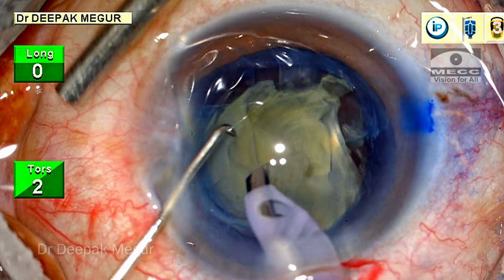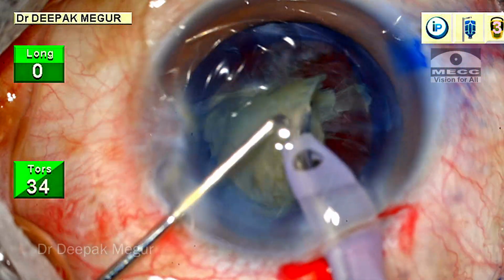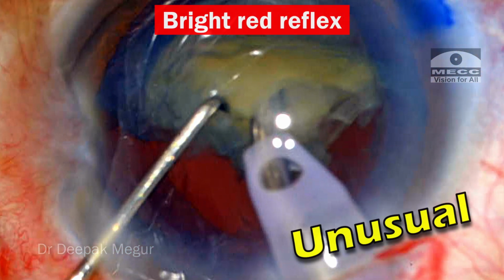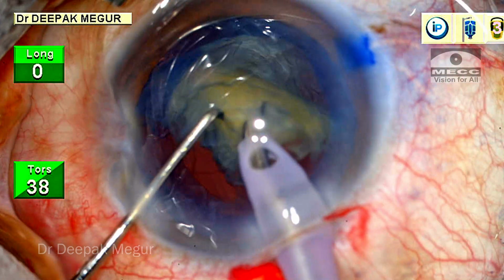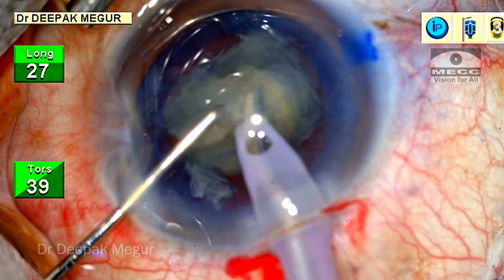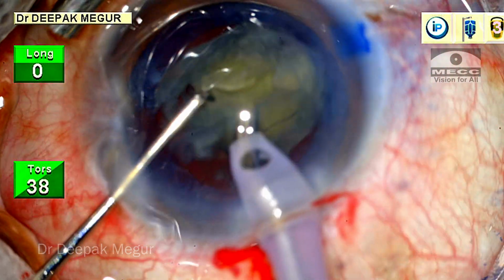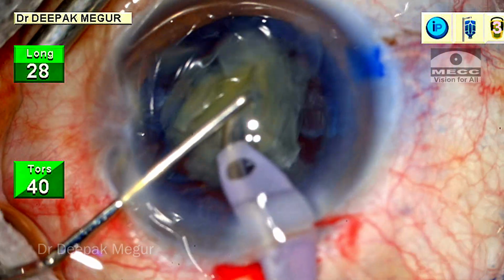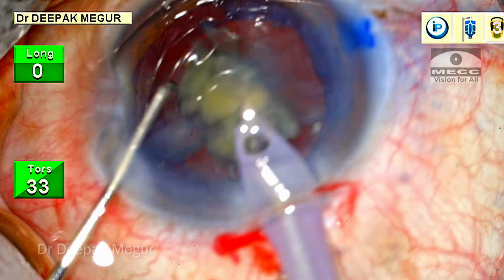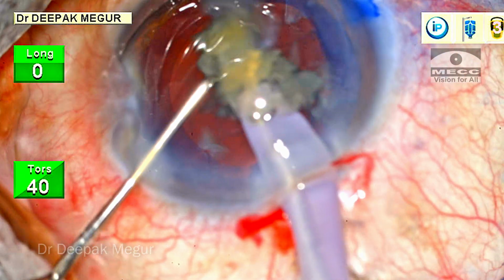As the last fragment is tipped out of the bag and then is being emulsified, something catches my attention. An unusually bright red reflex posterior to the nucleus has caught my eye. This, I thought, is a little bit unusual. Nevertheless, the emulsification is going on pretty well. The followability is excellent, so it looks alright, but this underlying red reflex is bothering me a little bit. As the last piece is getting emulsified, something is not looking alright.